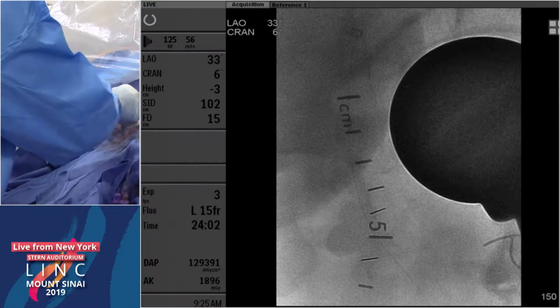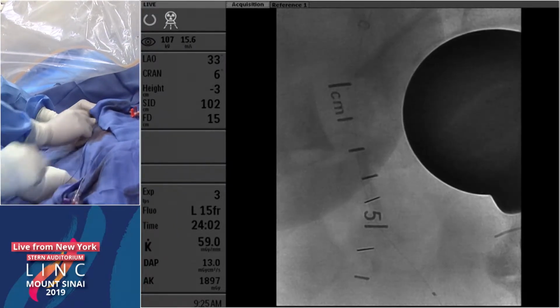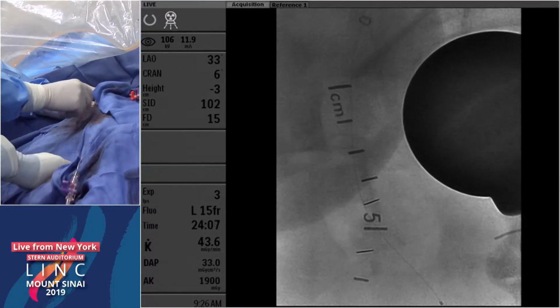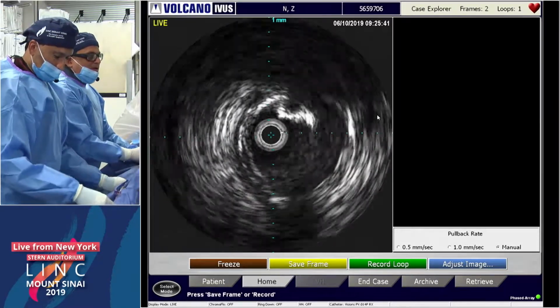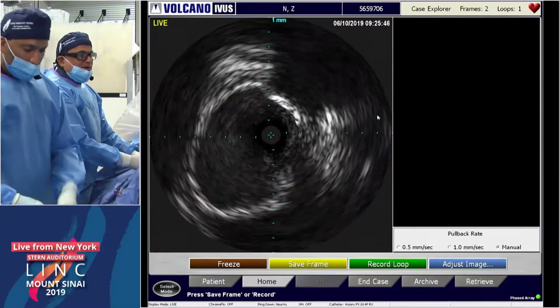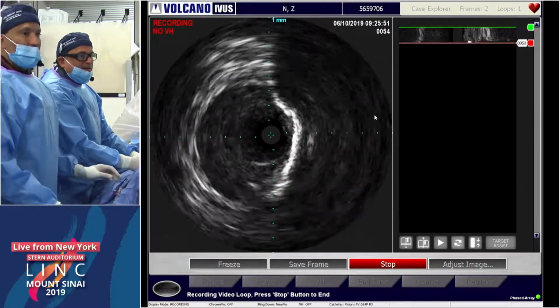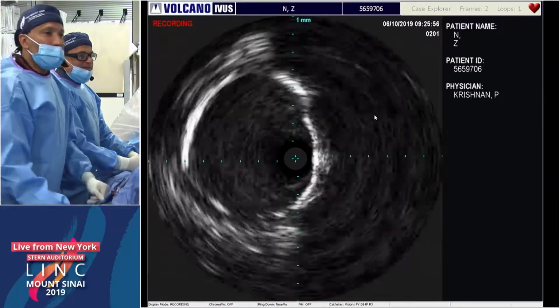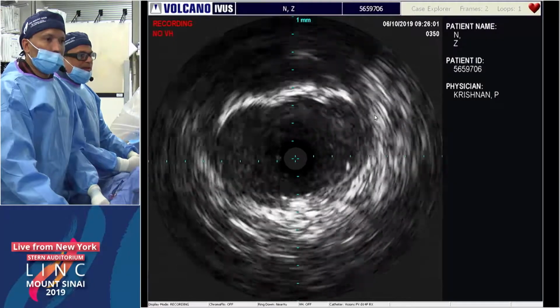Yeah. But I don't really get the point. If you have a lesion which is perfect for a biomimetic stent, why is not having a stent an advantage? I think here we don't have the size available. The biggest one we have is 6.5. So that's one of the reasons. Let's do a recording. We would have to put an 8.0 nitinol-based stent here. And here you can see, as we come back with the IVUS, we've got very good luminal gain. See, PK, look at the luminal gain. That's the lesion right there.